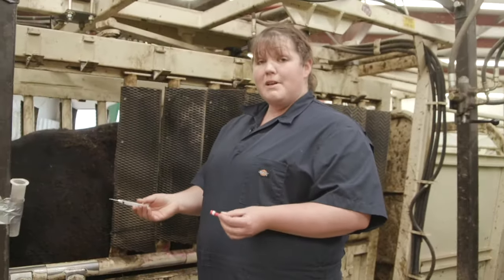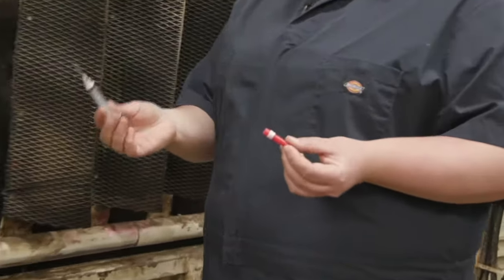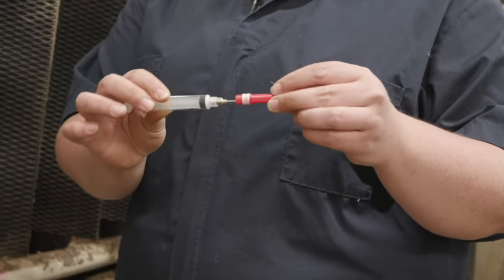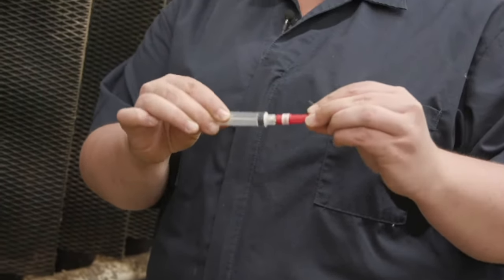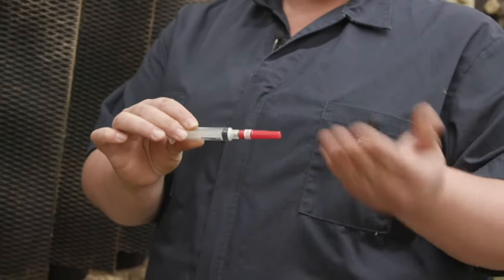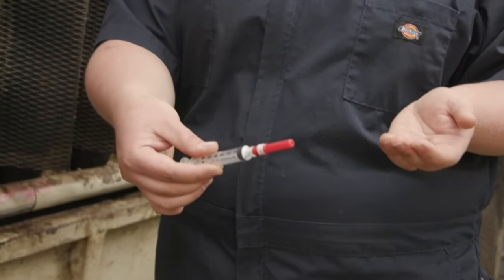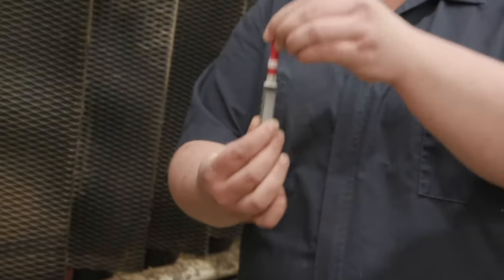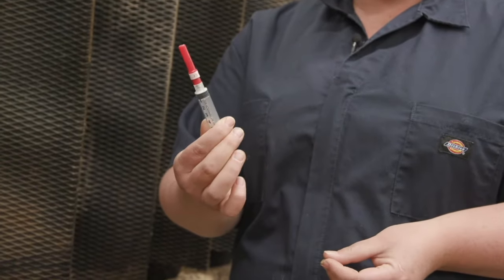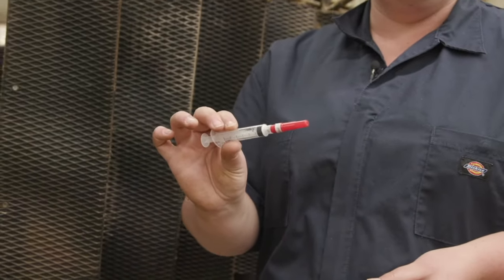When you go to recap a needle, be conscientious of where the sharp end is and where your cap is. If you're careful, you can cap it using your alternate hand. If you're not confident with that, place your cap on a flat surface, then slide your needle into the cap, lift it up, and press your cap on firmly. Once your cap is on, then you can discard your needle as needed.